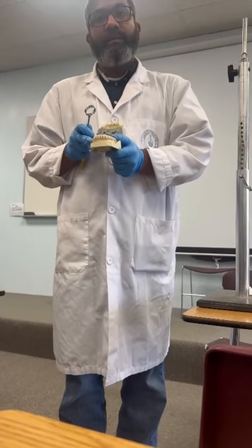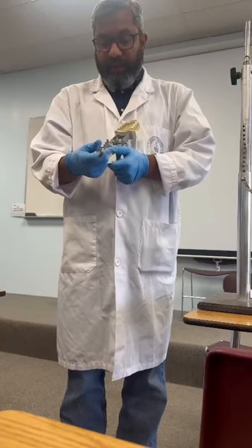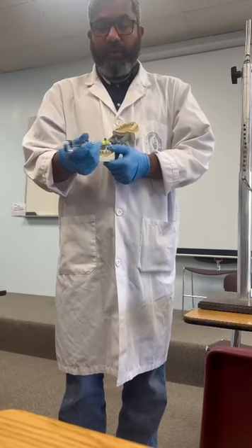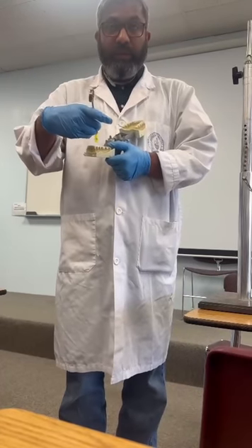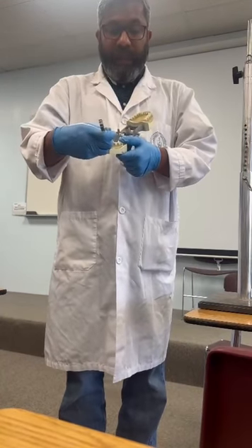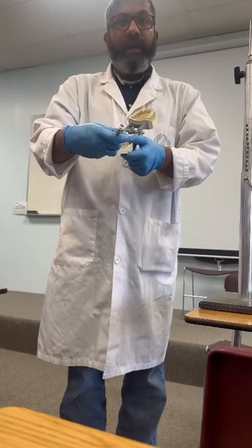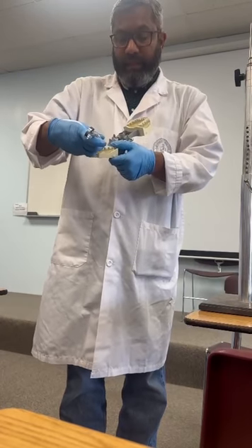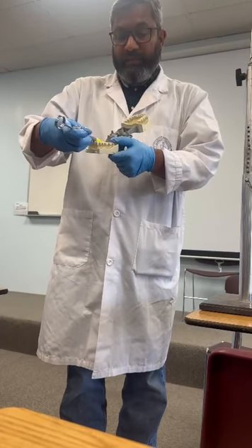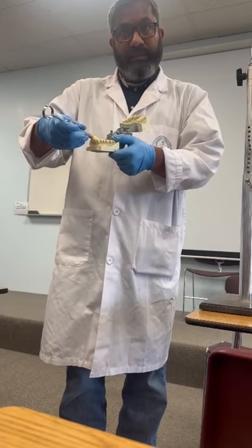the buccal side. Usually when they give the inferior nerve block injection, they push half of the cartridge all the way in like this, and then they change the direction. They first go like this, give half of the cartridge, then change the direction and push all the rest of the material here.